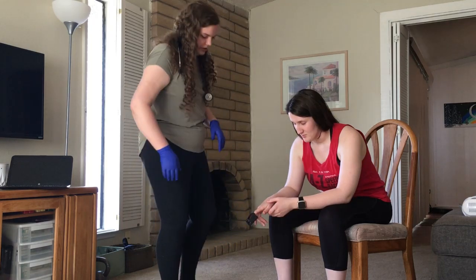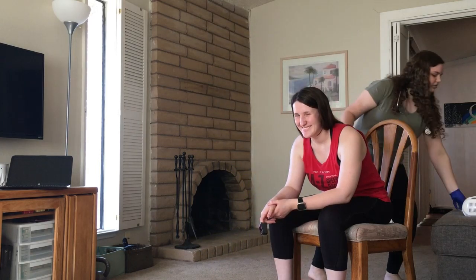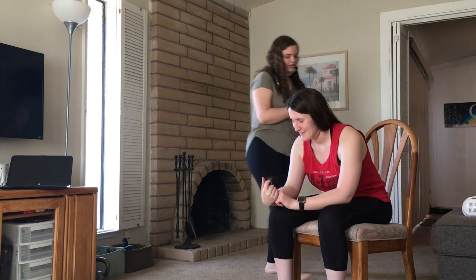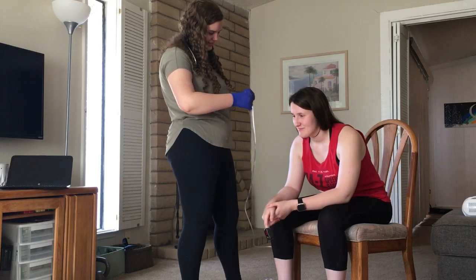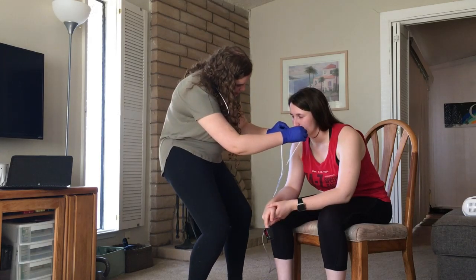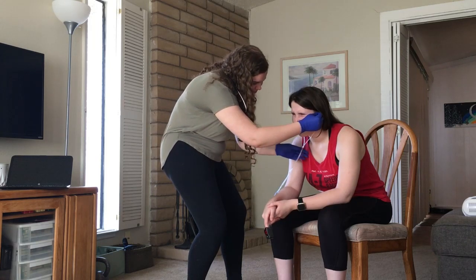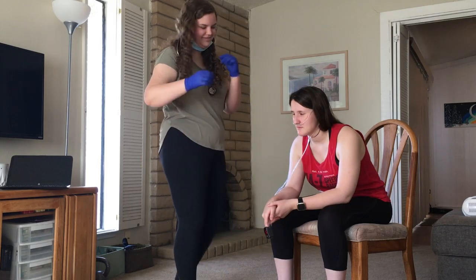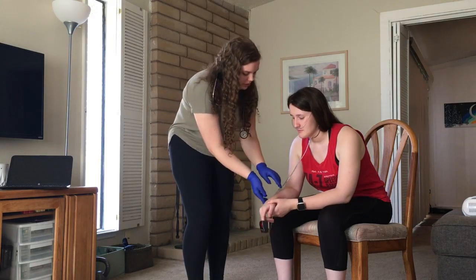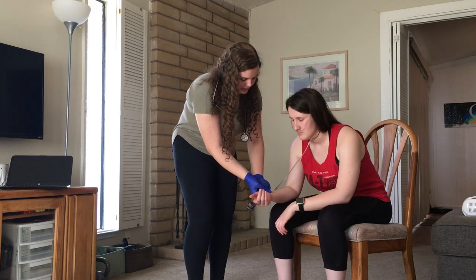Your oxygen is a little low and your heart rate is high, so I'm going to get you started on a nasal cannula, some oxygen at 2 liters per minute. Here. It's going to be a little uncomfortable. I'm going to check your pulse just to make sure the pulse ox is working, and temperature.